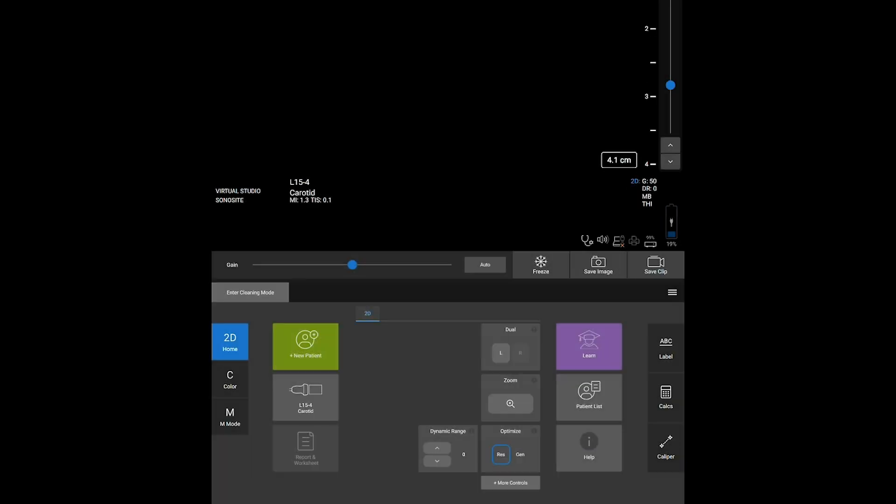You can also navigate to the Learn feature to view videos, use the patient list to view previous studies, and access onboard help in just a couple of taps.